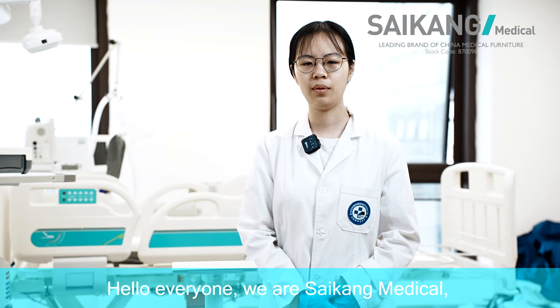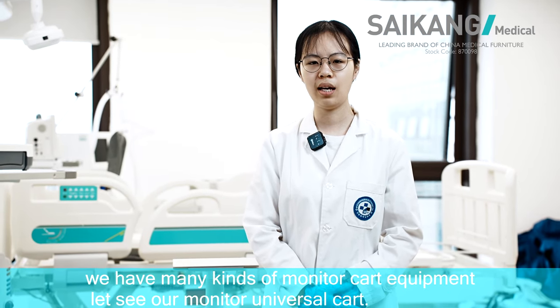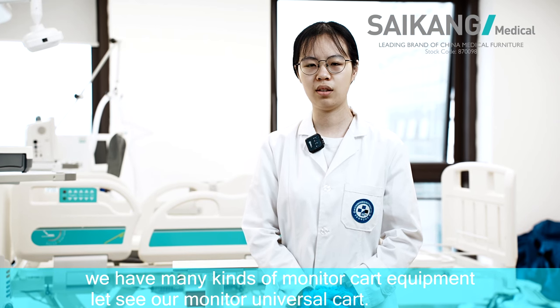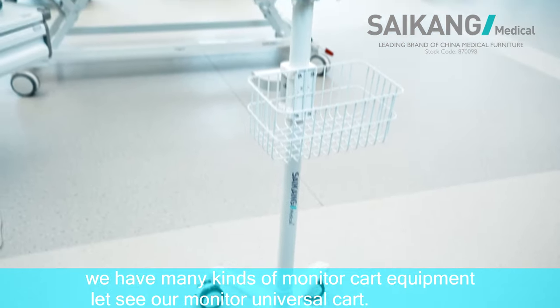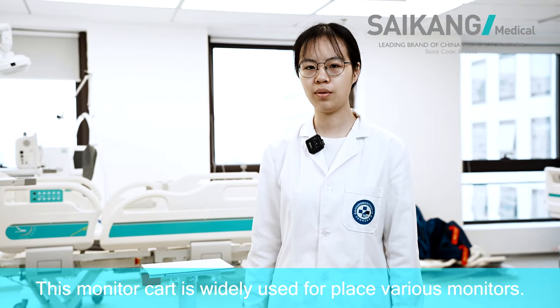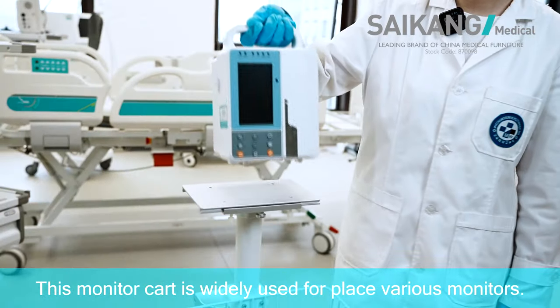Hello everyone, we are Saikon Medical. We have many kinds of monitor equipment. Let's see our Monitor Universal Cart. This cart is widely used for placing various monitors.